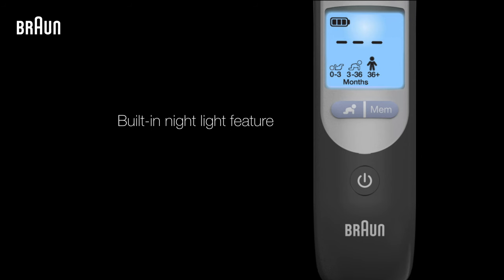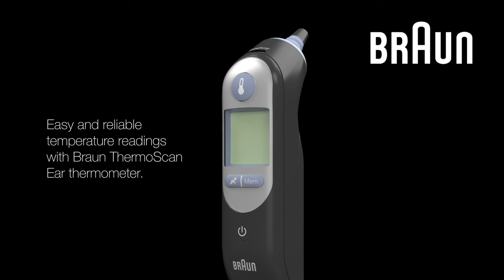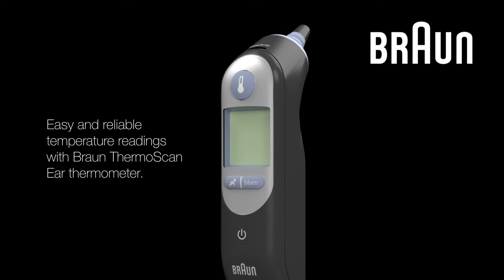This thermometer also has a handy nightlight feature where the display will light up for 15 seconds when any button is pressed. That's all there is to it. Experience easy and reliable temperature readings with your Braun ThermoScan Ear Thermometer.